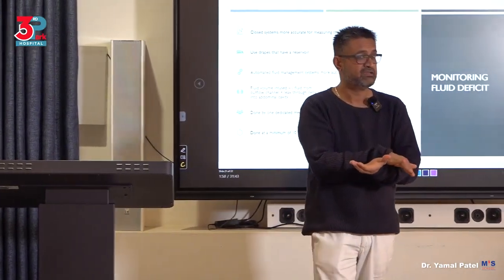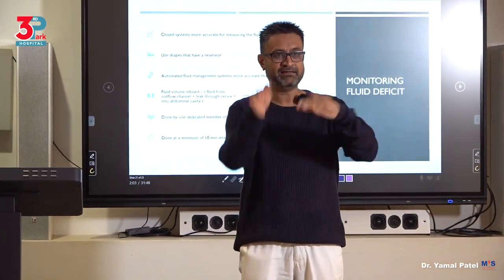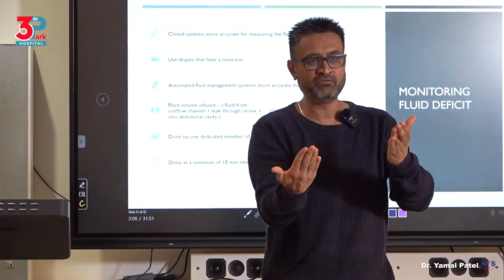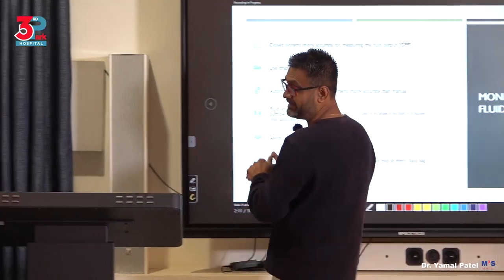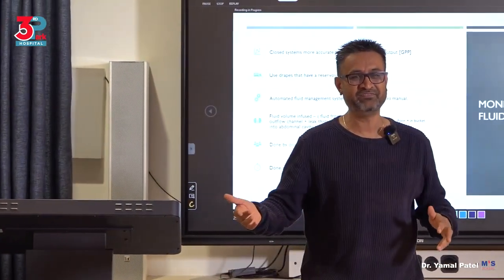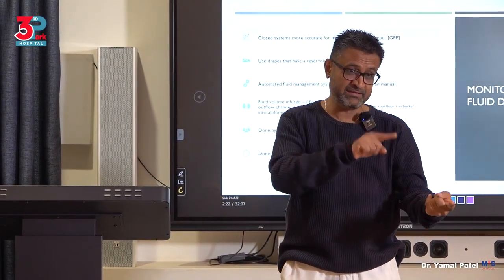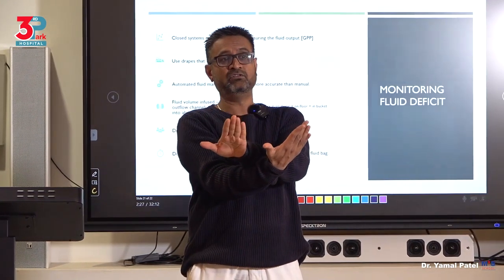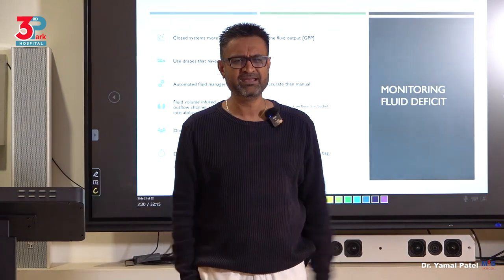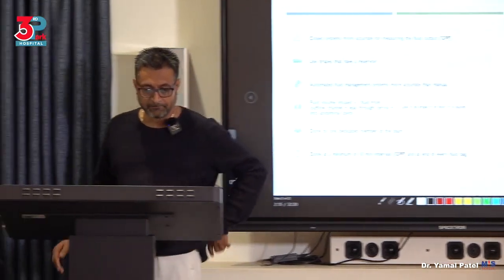Are we understanding, Joy? When I'm going to do something like polypectomy or myomectomy, this underpad turns this way, not this way. I don't want the fluid to be absorbed. That's not what it's meant for, okay? Good, so that I can count. The reason I don't is because I don't take that long. I'm done in 15 minutes. But if I am to do a complex procedure, and the underpad is that way, I can calculate. If the underpad is white on top with that material that just absorbs fluid, how will I know how much has been absorbed? How will I calculate? Think about it.